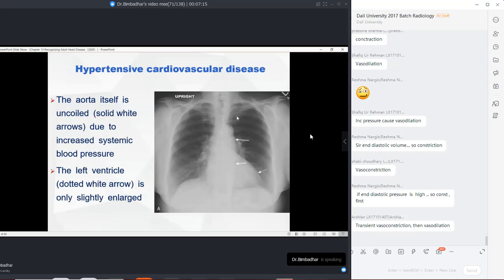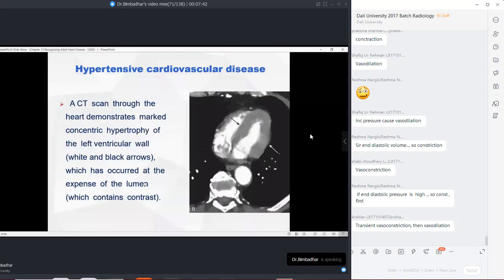Did you get it? The aortic knob and the descending part, here itself, see the ascending aorta and the aortic knuckle are the ones that are being influenced by this, right? Did you understand it? So that is the first thing that can also be seen in hypertension.